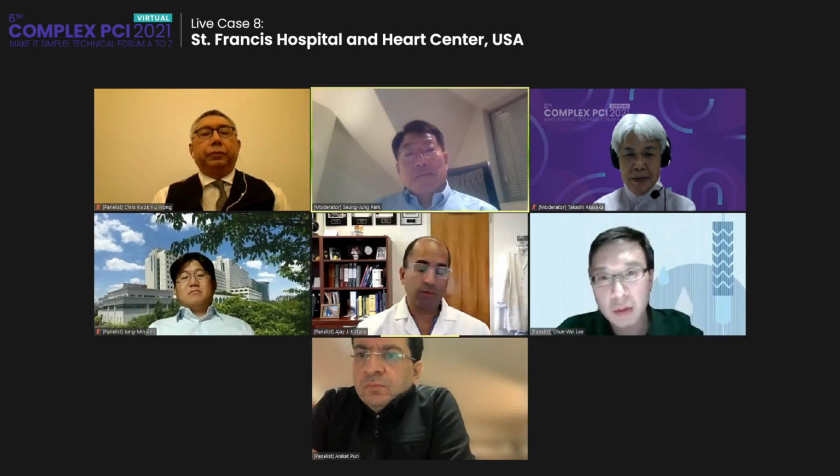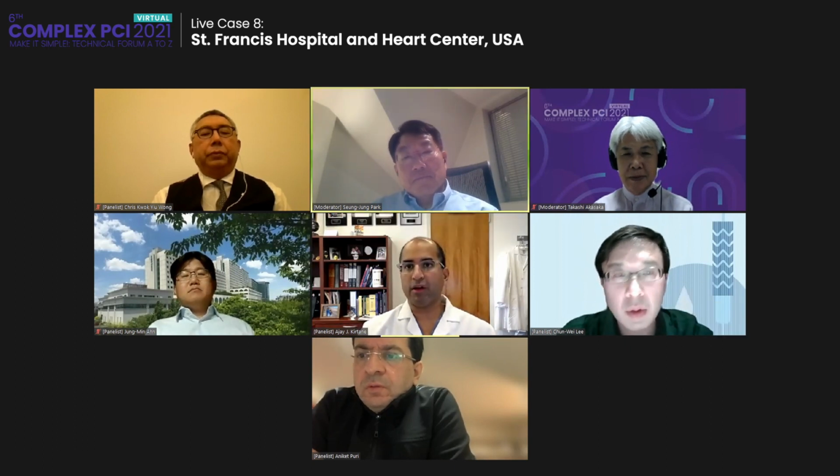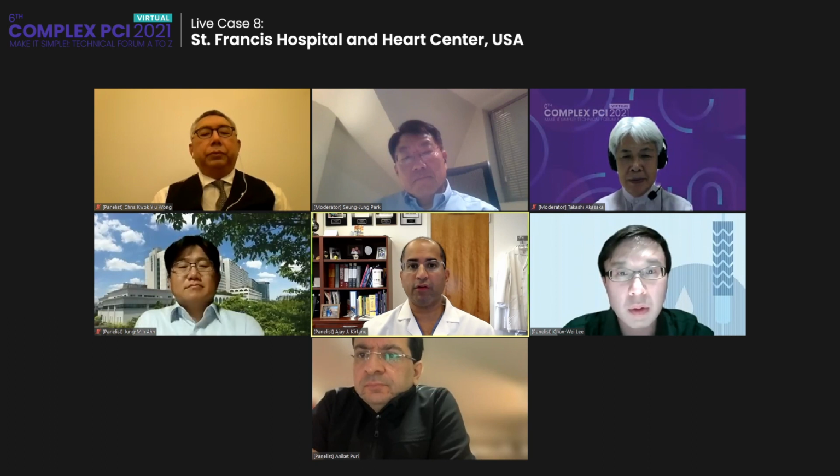Yeah. So we tend to use it much less frequently because the cost is very expensive. Like you, our experience has been, for instance, all the pre-TAVR cases. As you know, we have a very high TAVR volume. A lot of these patients have calcification, and many of those patients do very well with NC balloons alone. So our mode is that we'll try an NC balloon first.